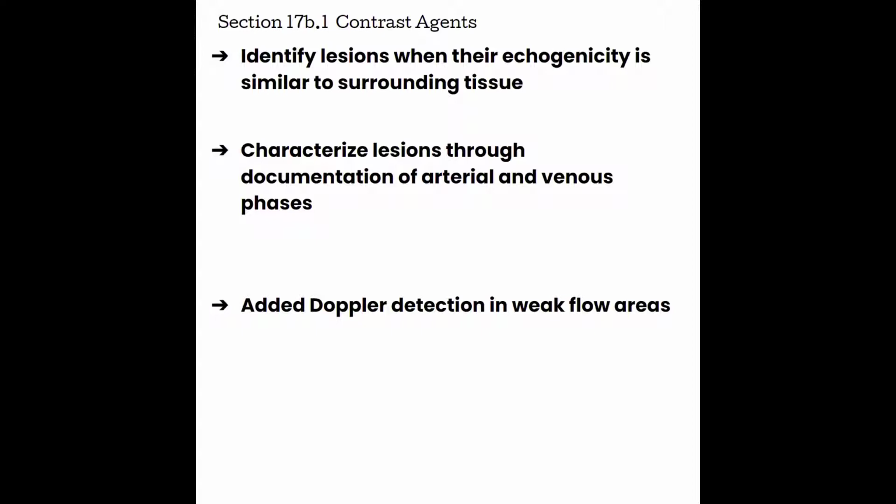So basically what we're seeing here is that the contrast agent is injected into the body through the IV. We're going to watch as the heart moves it around. We can look in the heart itself, see the contrast agent in there. It'll help us to identify filling defects within the ventricles. It can help to identify how the walls are moving. It has a lot of fantastic uses in the cardiac realm.